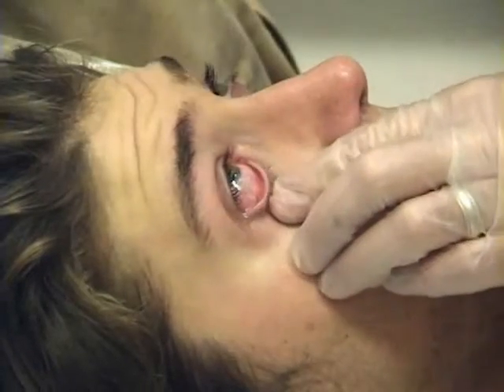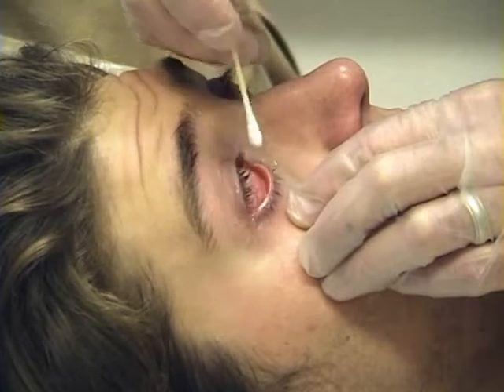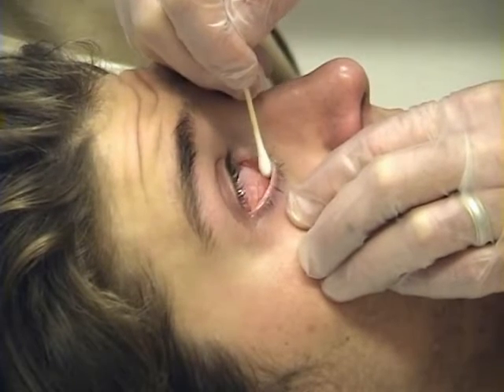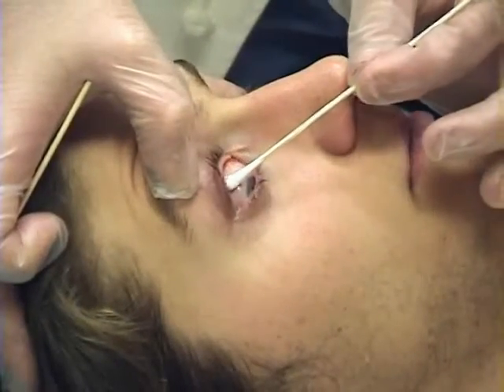If there is suspicion of particulate matter in the eye, sweep it out with a moistened cotton-tipped applicator prior to irrigation. Both the inferior and superior fornices should be swept.